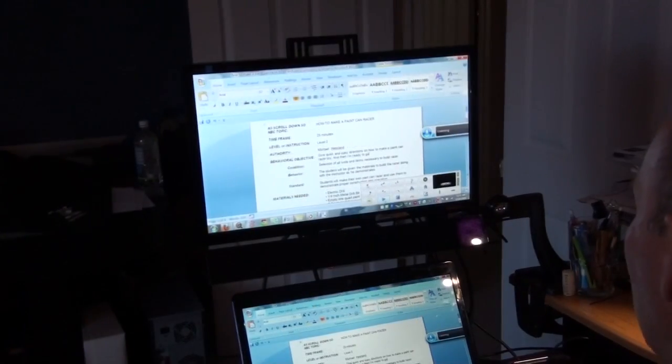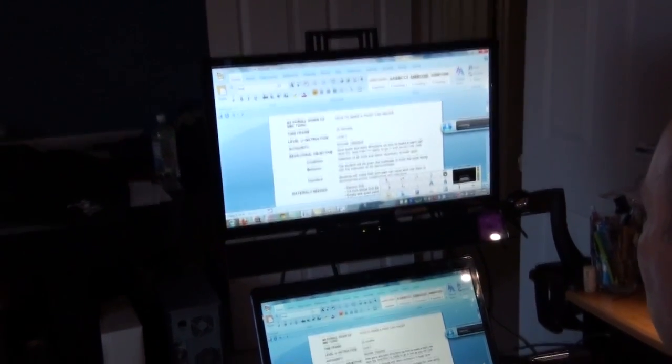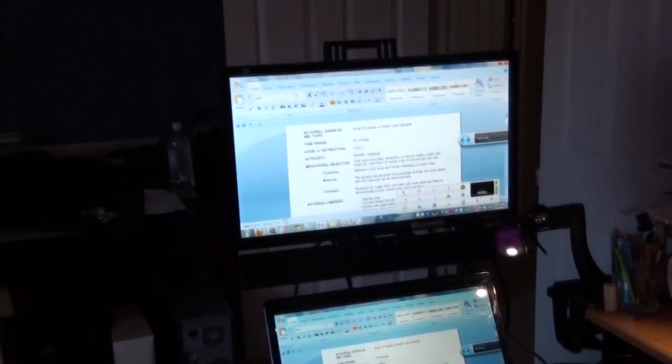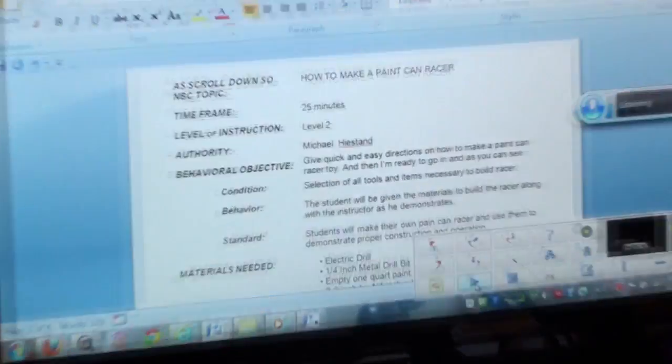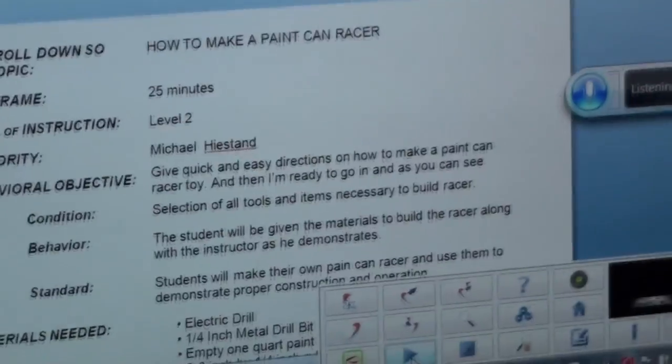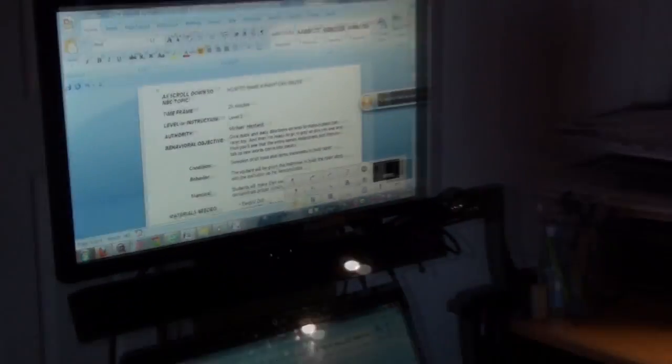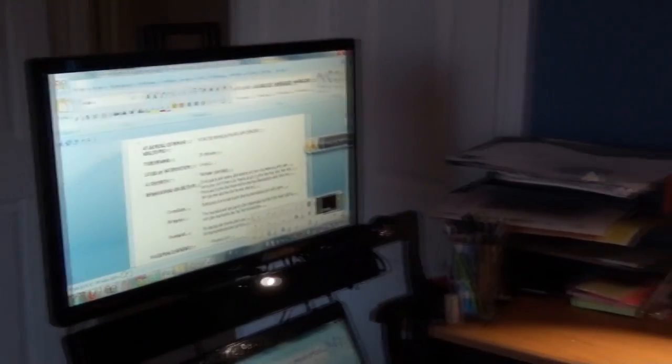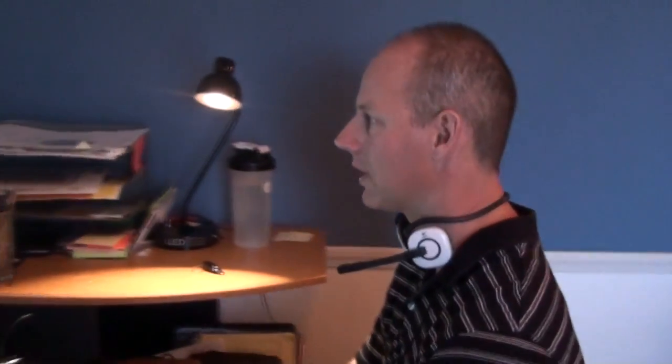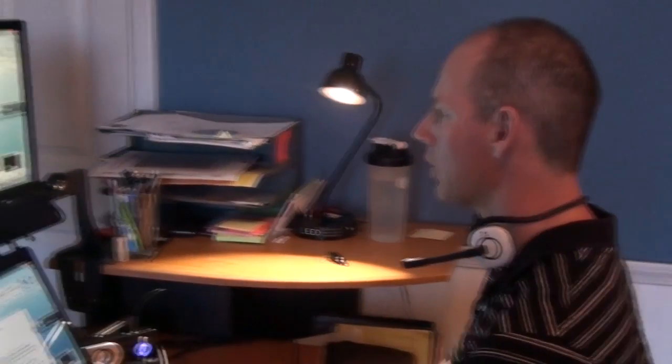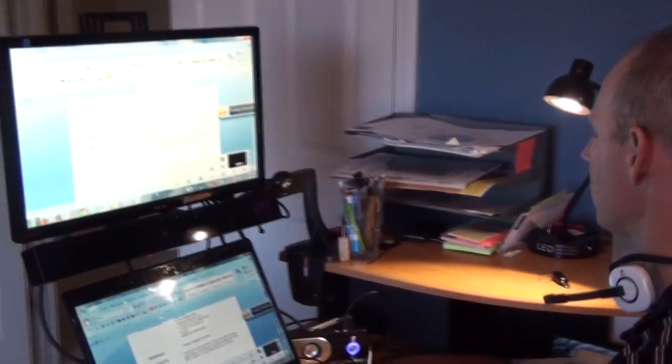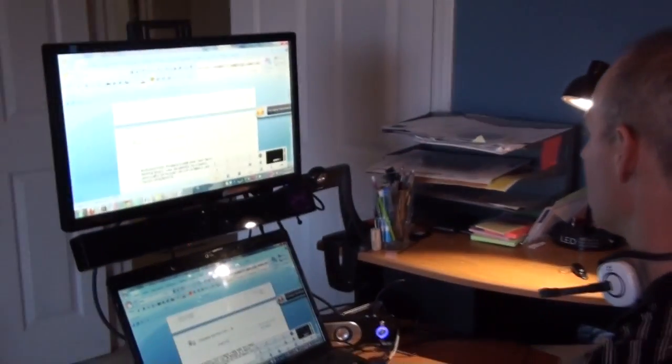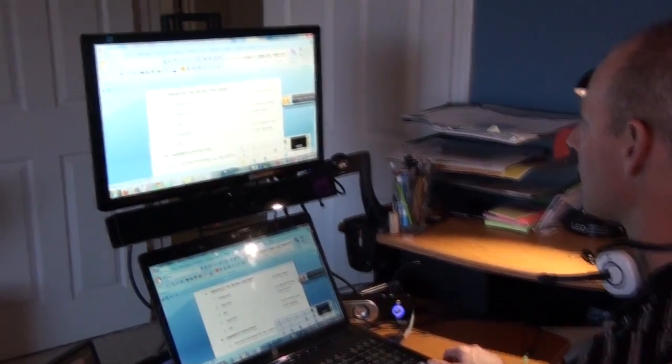And then as you can see, as I talk, the words automatically go up. I've got my adjustments made to this particular part of the document, but now I want to scroll down to a different part. What I can do is I can use my eye mouse, I can go over to the sidebar, and click on it, and it will scroll down through the document itself.